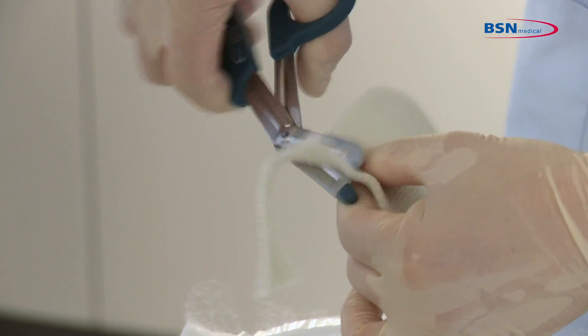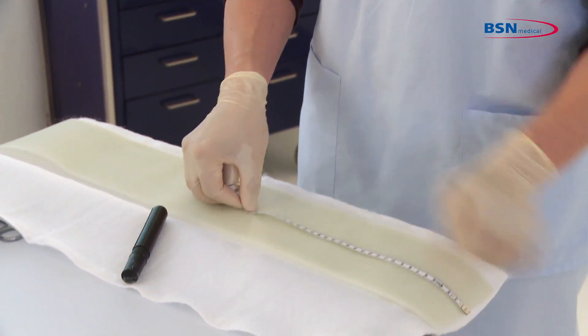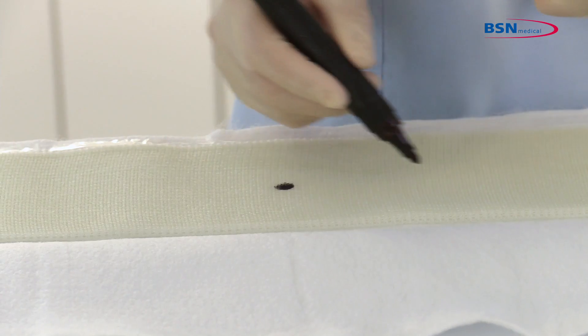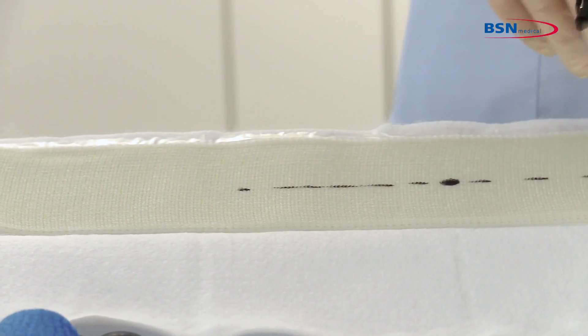For smoother edges of the substrate, trim them with scissors. Now mark a point at the base of the heel. Follow the substrate approximately 10 cm, 4 inches in both directions and draw a horizontal line.